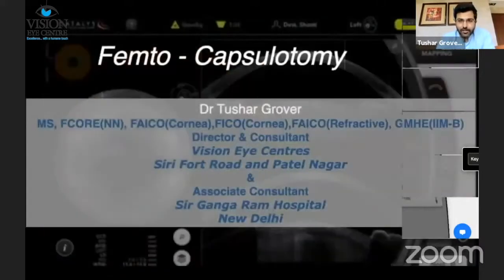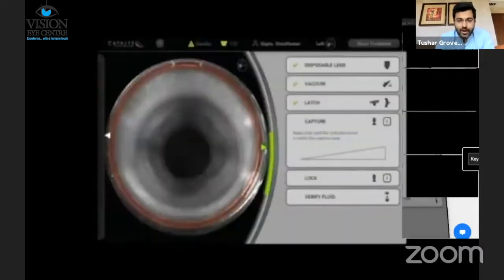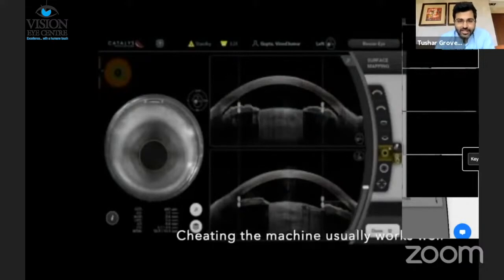I'll be talking about issues that happen with femtosecond capsulotomy, and one of the common situations where this happens is when you have a small pupil. Something that usually works well is by cheating the machine a little bit — we manually adjust the diameter of the pupil that the machine has detected and increase it manually.